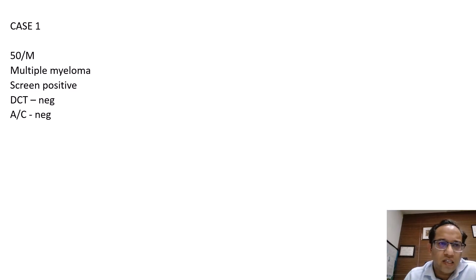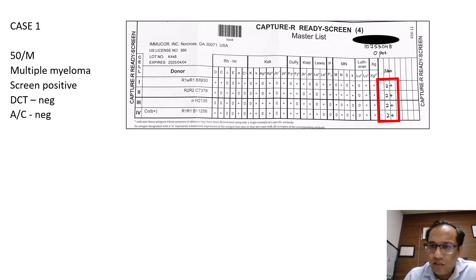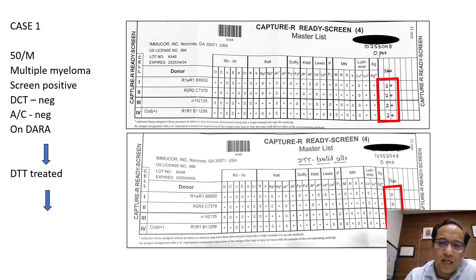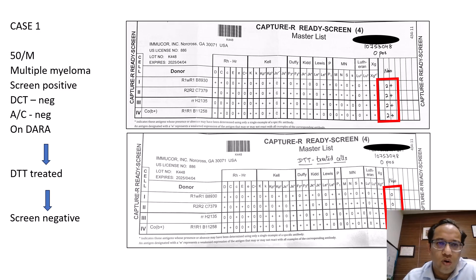I will start with the first case: a 50-year-old male patient with multiple myeloma whose antibody screen came positive, DCT is negative, auto control is negative. There is pan-reactivity — weak reactivity at around 2+ in all panels. Since there was a history of DARA, we treated the cells with DTT, and after that the screen came negative. We could solve this case and provide compatible blood.